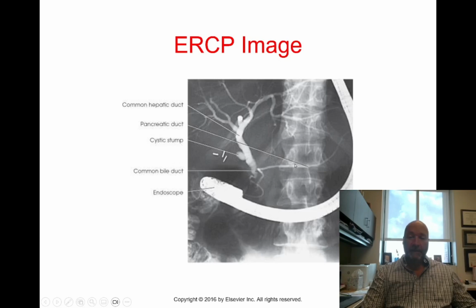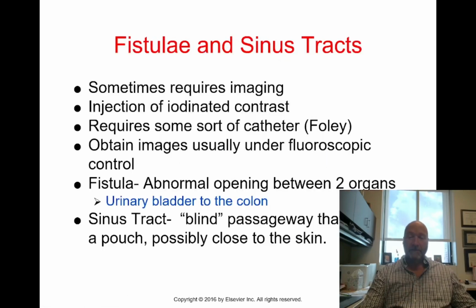So you've got the pancreatic duct here. If we had a duct of Santorini, it would come off maybe here and go up. But also, if they're doing the ERCP, they may actually see a second opening into the small intestine that would indicate that the patient has a duct of Santorini that goes all the way to the small intestine. Duct of Wirsung is the pancreatic duct. Accessory is the duct of Santorini. Sorry, I keep flipping that around.